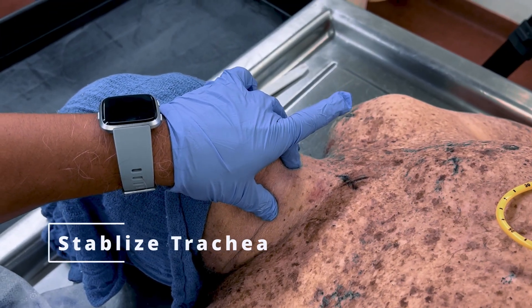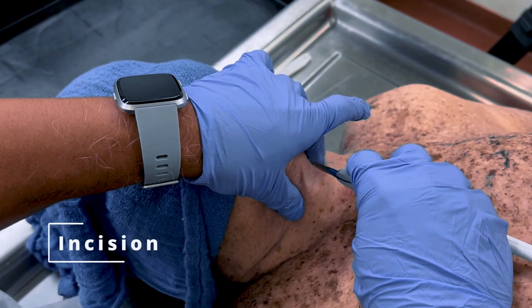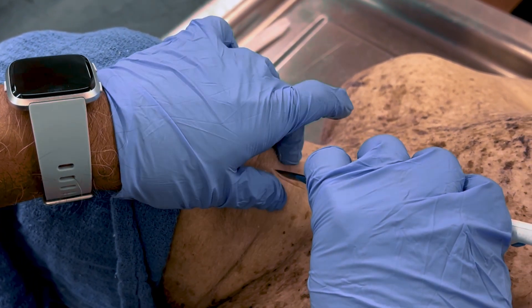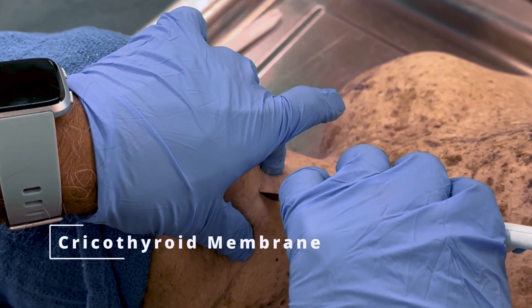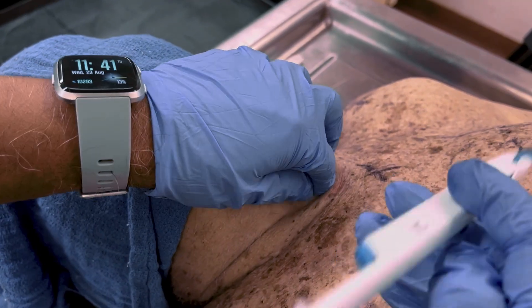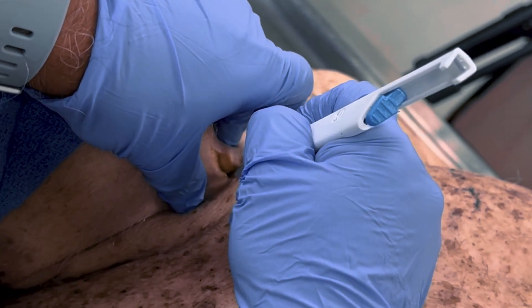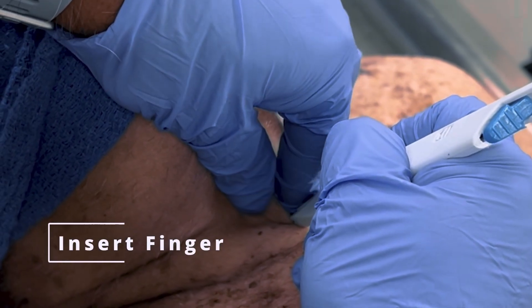Stabilize the trachea by applying finger pressure bilaterally with the thumb and middle finger. With the scalpel, make a vertical incision about 4 to 5 centimeters long through the epidermis and adipose tissue over the membrane, exposing it. Continue to stabilize the trachea. Use your index finger to identify and expose the cricothyroid membrane. Make a horizontal incision about 2 centimeters across the cricothyroid membrane. Take care to avoid making any horizontal incisions into the skin. Insert your finger through the cricothyroid membrane as a placeholder and to confirm the location.